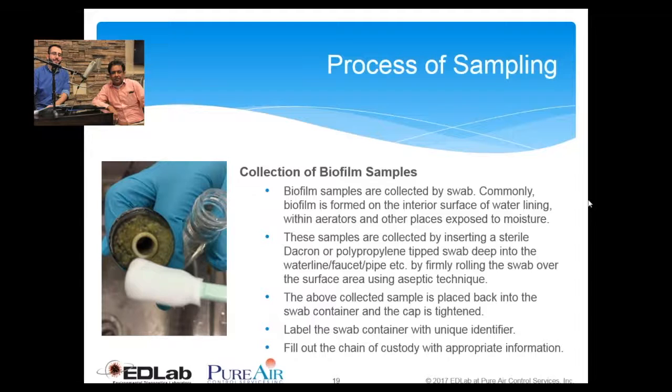So it is a very good idea to open those joints and see if you find any kind of sediment, which is typically a little bit gooey, and you can't miss it, as you can see in this photo, that there is a biofilm deposition around the neck joint between the faucet and the water supply.